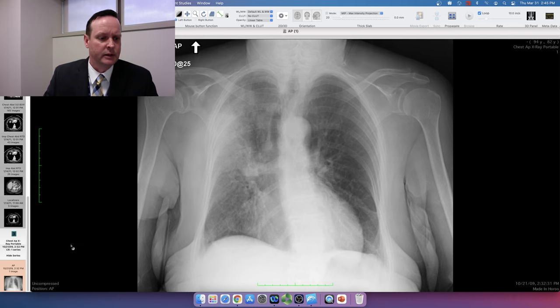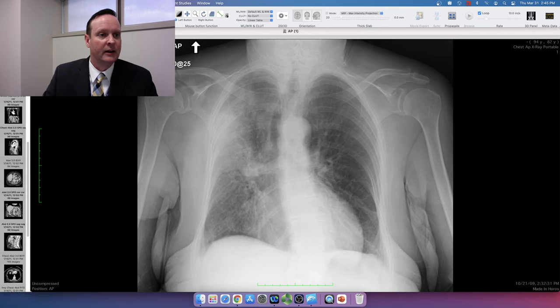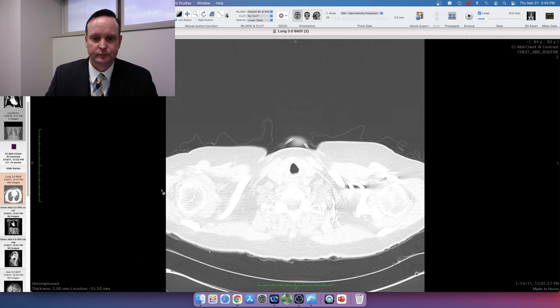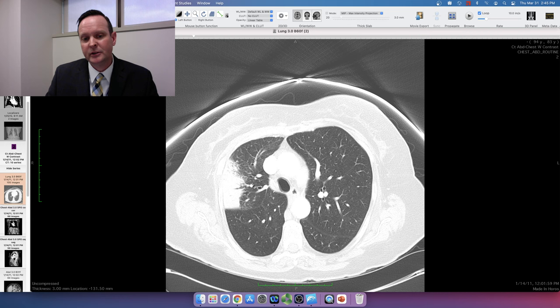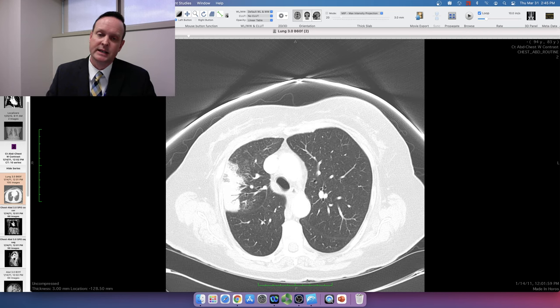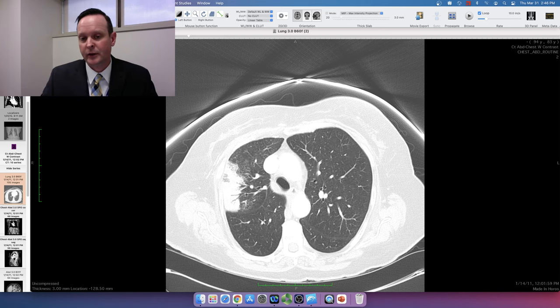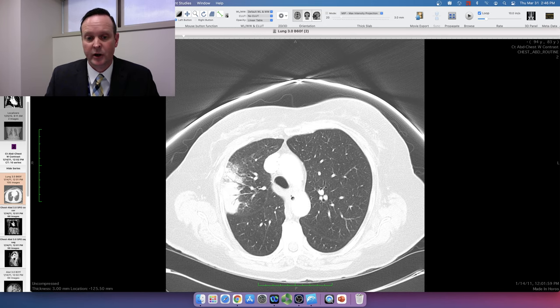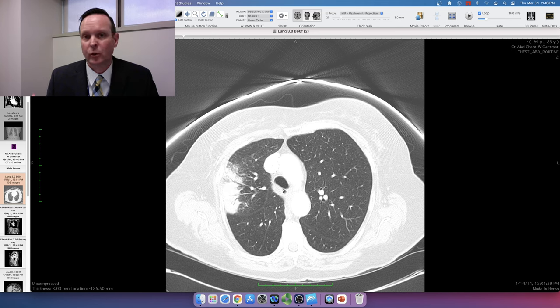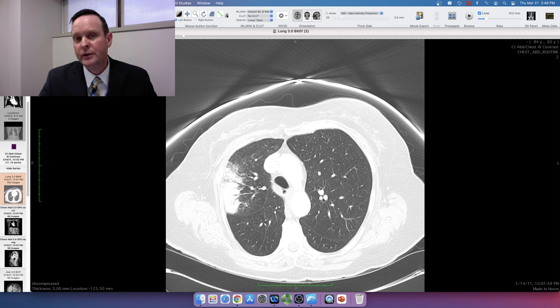For this patient, who had this chest x-ray obtained in 2009, we have a follow-up chest CT from two years later showing a very similar consolidation, and this is just a sampling of the patient's multiple studies throughout their care. The key point is that this is a chronic consolidation — it has all the characteristics but it didn't go away. After six weeks, a consolidation is considered chronic, and my differential changes.